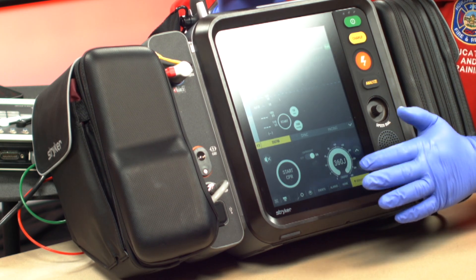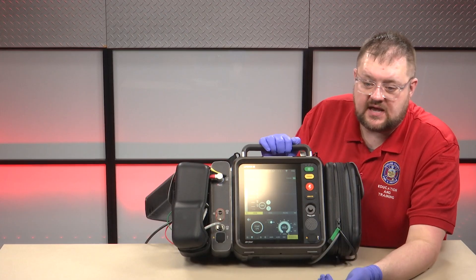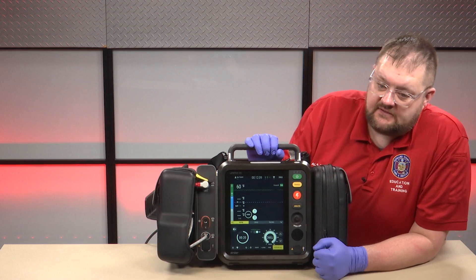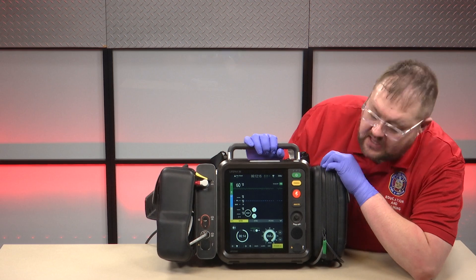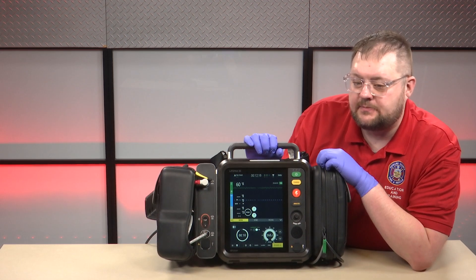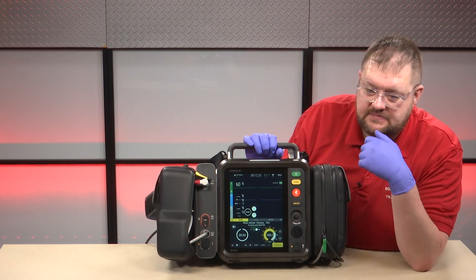Right now we're just going to assume I have an adult patient. One of the features of the LifePak 35 is CPR Insight, which you can see here that I have switched on. When CPR Insight is on, the LifePak 35, through a proprietary method, is able to read the rhythm underneath the CPR.